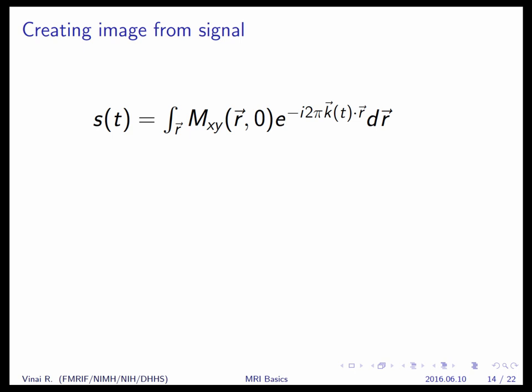As I said, the form of this equation is exactly the form of the mathematical construct called the Fourier transform. And essentially, if you take the inverse transform, or you do the inverse of this equation, you can recover Mx0, which is your image, your distribution of protons in your slice. Okay. Do you plan to talk more about that? So Andy will talk a little bit more about that on Monday in the advanced lecture, but this is the basic idea, the concept behind this. Okay.